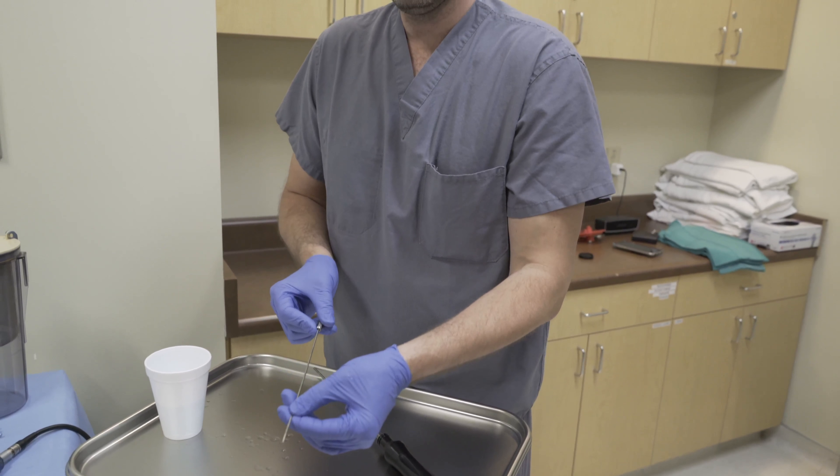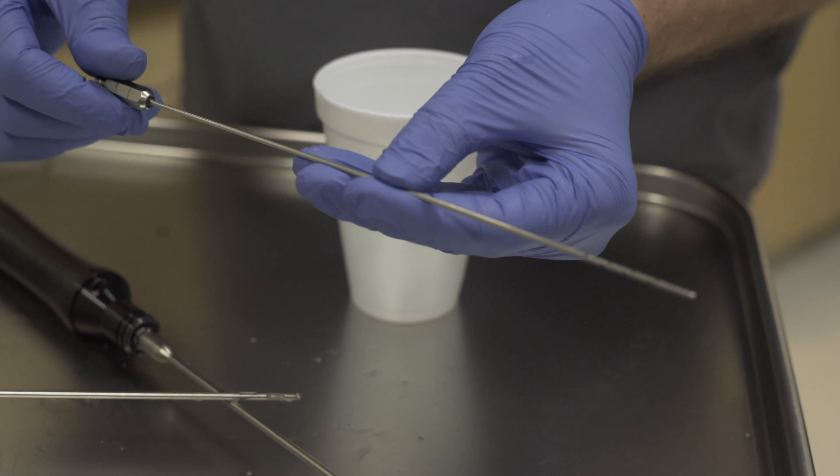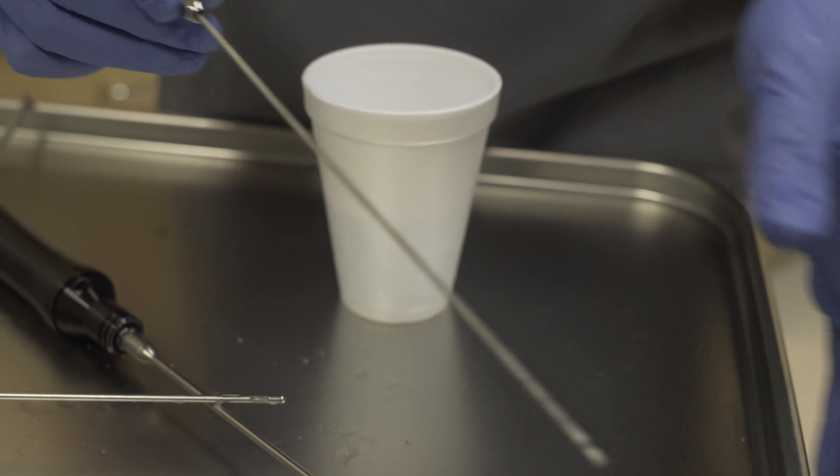The first thing you see us do is use this tiny little cannula with a couple of little holes. What that does is put fluid in — a clear fluid that has both a medication to stop bleeding and a medication that stops pain. So it basically numbs your skin.